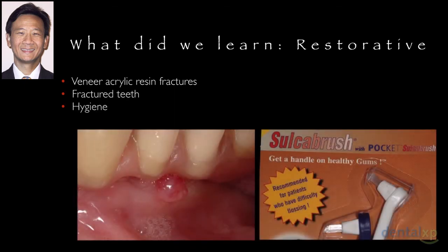Design of the prosthesis is also crucial for hygiene. In those initial days that implants are integrating, the design of the prosthesis is crucial so that patients have access. Any overlap or any overlapping pontics made it difficult for these patients to clean. And so therefore, oral hygiene instruction and use of different aids such as the Soft-Picks or brush was crucial in helping these patients with soft tissue lesions that were caused because of inability to clean around the prosthesis.